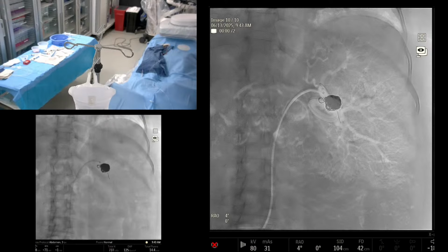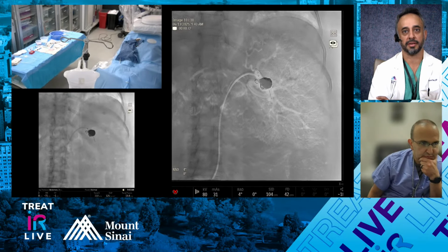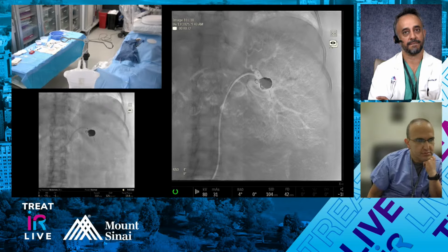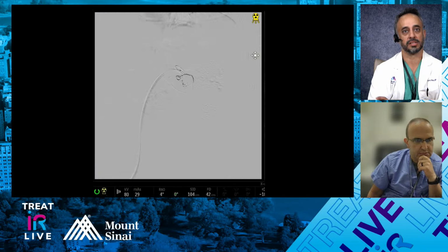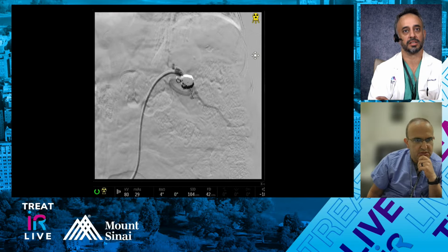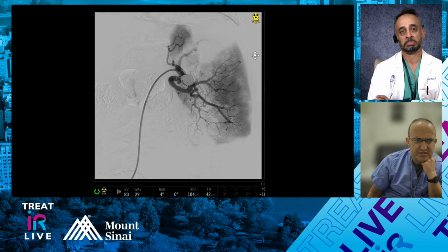So Ed, while you're stepping out to do the run, did you heparinize this patient during the case? Because you obviously have the sheath up around the celiac and splenic artery. We just have a good side flush. No, we did not heparinize. We have a side flush for sure with heparin, but we didn't give any heparin. Rose, do you usually heparinize your patients? No, it depends.